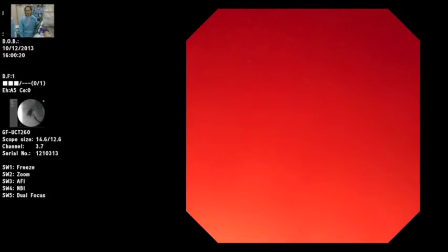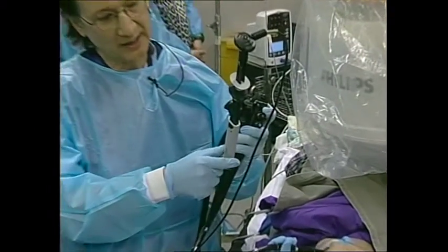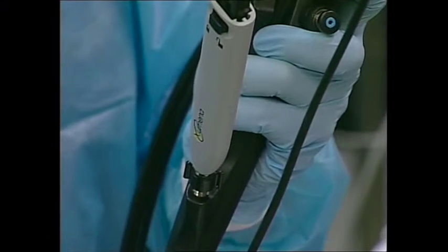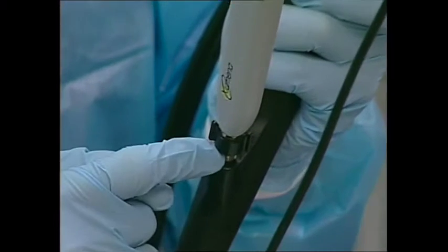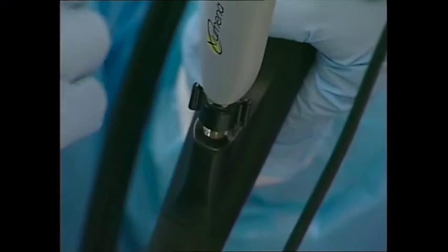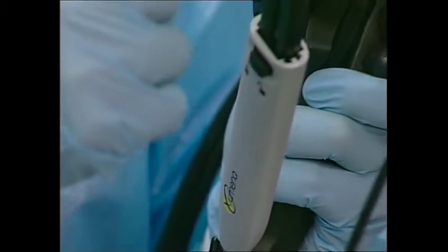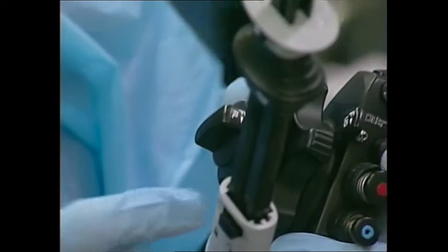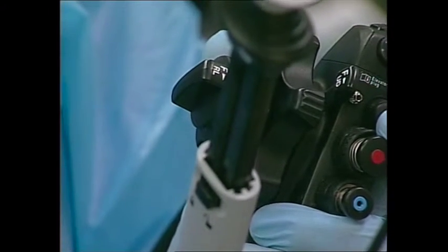Now we are back to do our hot entry into the gallbladder. I have inserted the handle no different than the way we would insert an FNA needle. It is luer locked to the port. And as mentioned before, there are two components here. There's hub number 1 and hub number 2. Hub number 1 advances the sheath forward, so that's the sheath that contains the constrained stent.